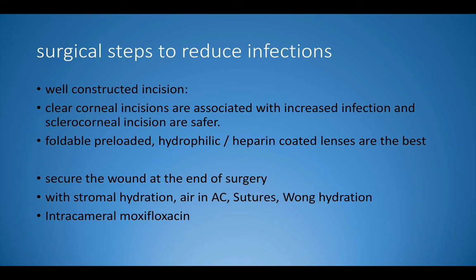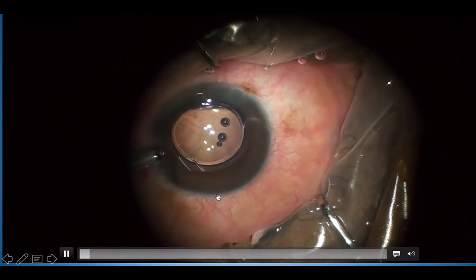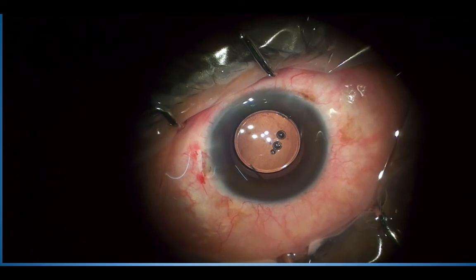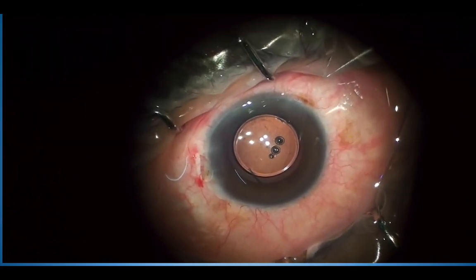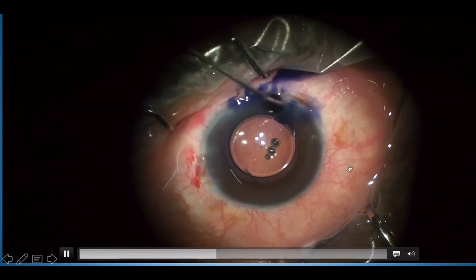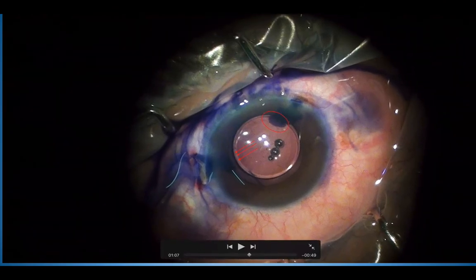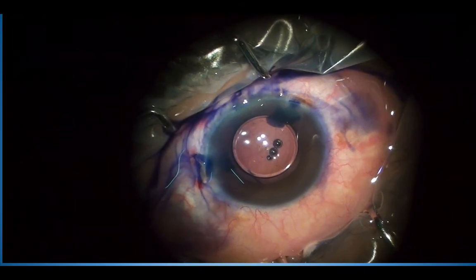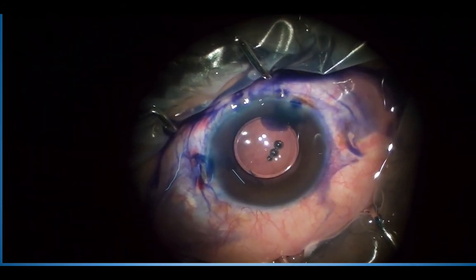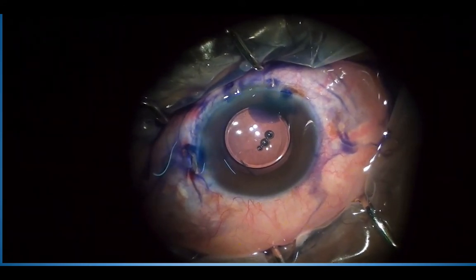Intracameral moxifloxacin will also help. Here we are seeing an example where we have finished surgery and completed irrigation and aspiration of the viscoelastic just before stromal hydration. Before stromal hydration I am putting a few drops of trypan blue at the side port and the main port. Amazingly, we can see the trypan blue flow into the anterior chamber within seconds. This shows that before stromal hydration it is possible for tear film to enter the anterior chamber during routine cataract surgery.